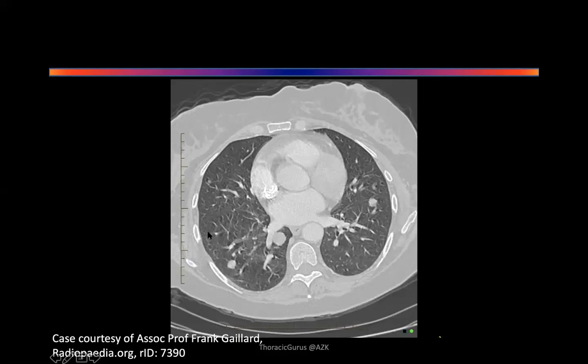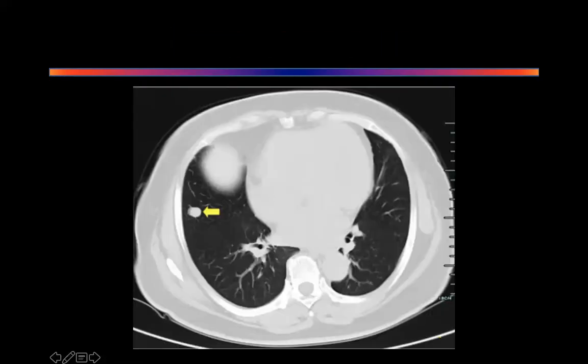Okay. What probable diagnosis? Prof, it's a lung with multiple metastatic lesions, and something must be compressing the SVC, and that's why we have put a stent in the SVC. Well, we don't know if it's a stent. Let's not go there, because at the moment we don't know if it is a stent or not. But yes, I agree with you that this is multiple metastases in the lung. Well done. Okay, excellent. Amina, stay with me and take this as well.